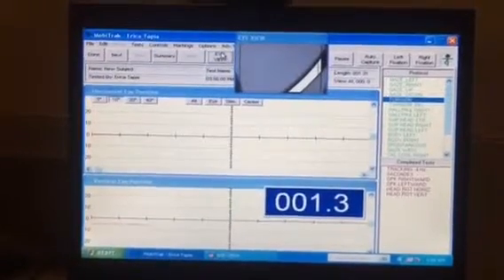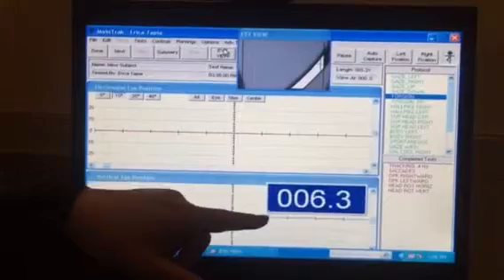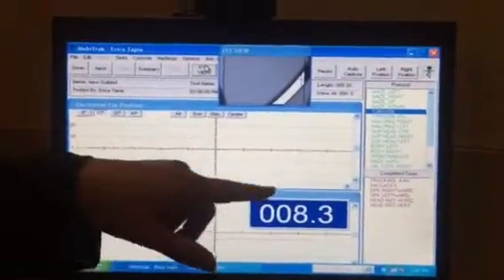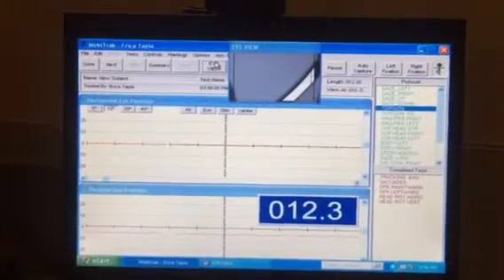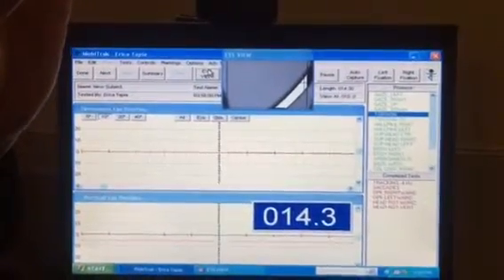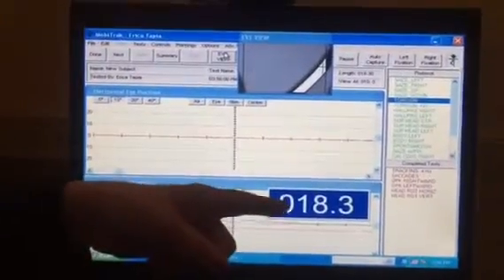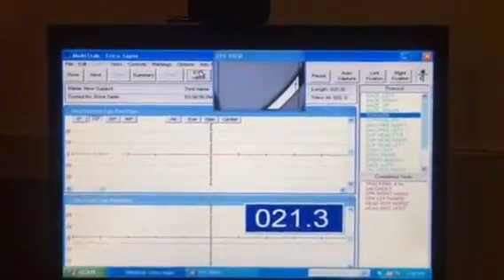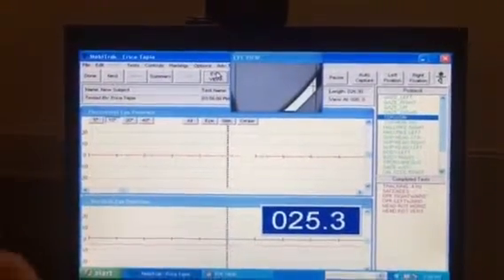Now, torsion happens. I have a large timer. That's the fist. Large timer fist, and most importantly, your little lens cap goes on. Oh, they're blind at this point. Okay, they are blind because this timer is for you. I see. Okay, so they're going like this. They're doing the torsion. Toro, toro, the bull.